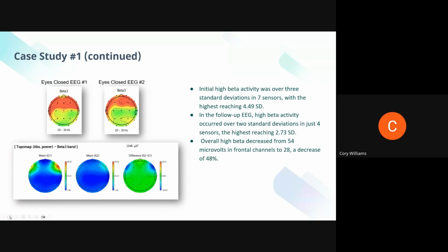So that's an example of why we want to do an EEG, why it's helpful to look at someone's brain when we're struggling to figure out the medication choices. This kid had all the hallmark symptoms of ADHD, but his brain was actually really fast, and so we wanted to work on slowing some of that down.